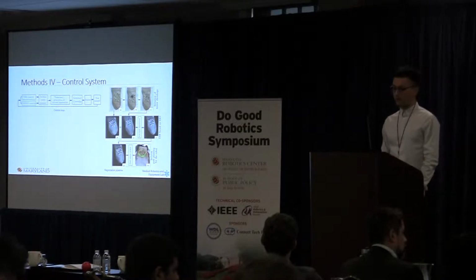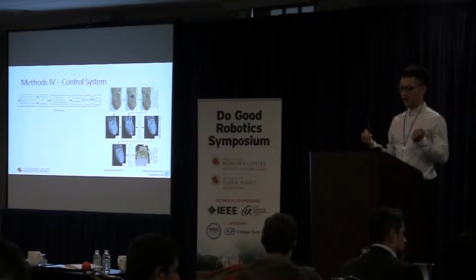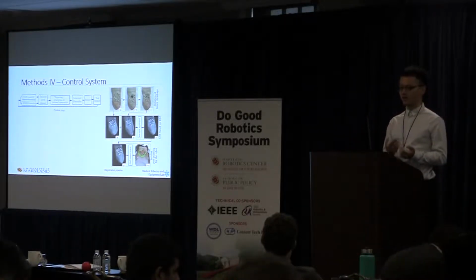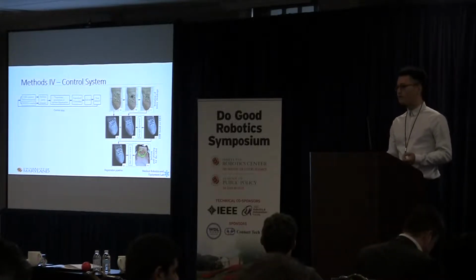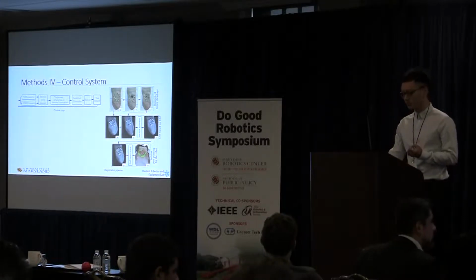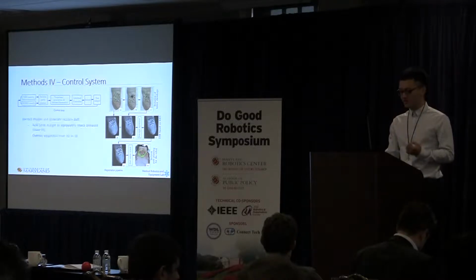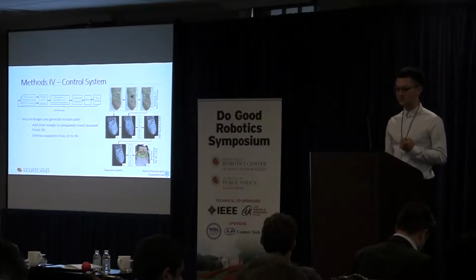After that, we register the deformed tumor shape, and then we want to integrate this proposed marking and tracking algorithm into our robotic system. We first give the pseudo-tumor contour in image F a 5 mm margin offset to adequately resect all the diseased tissue.